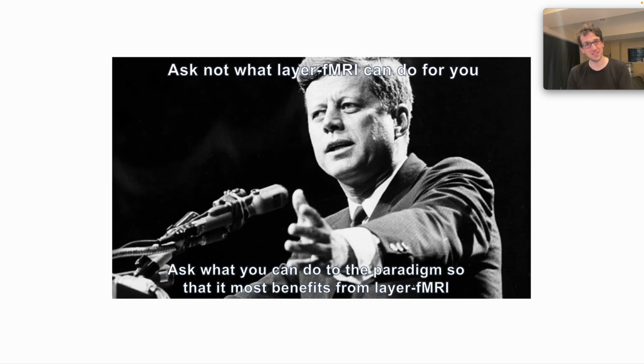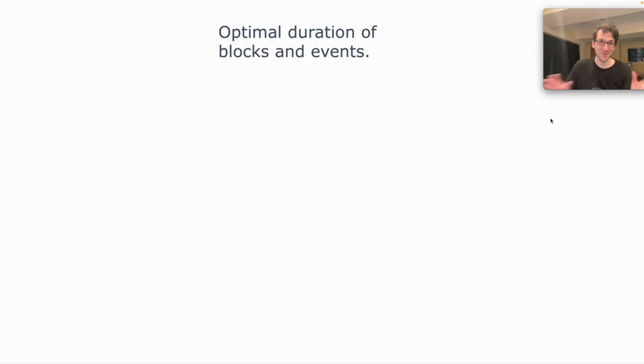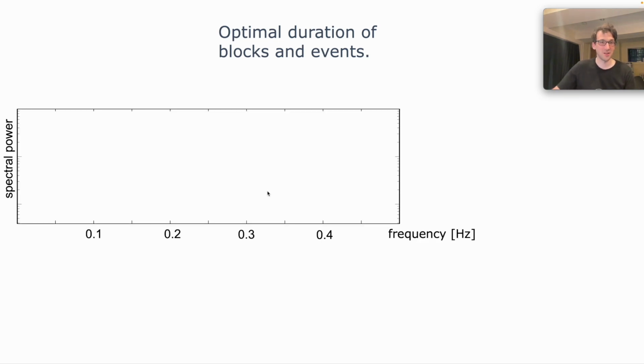It might change the timings, it might be annoying, and you might need to have fallback options to some of these very clever, ancient designs that allow you to answer specific fast neuroscience questions and processing questions at a lower spatial scale. But very often it can be very advantageous to also redesign your neuroscientific protocol, even though you're very familiar with it already. One approach in doing that would be, for example, really focusing on the time domain.